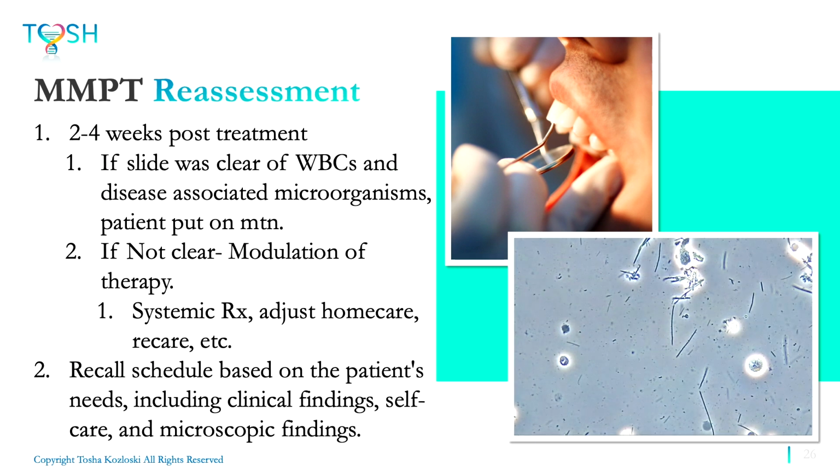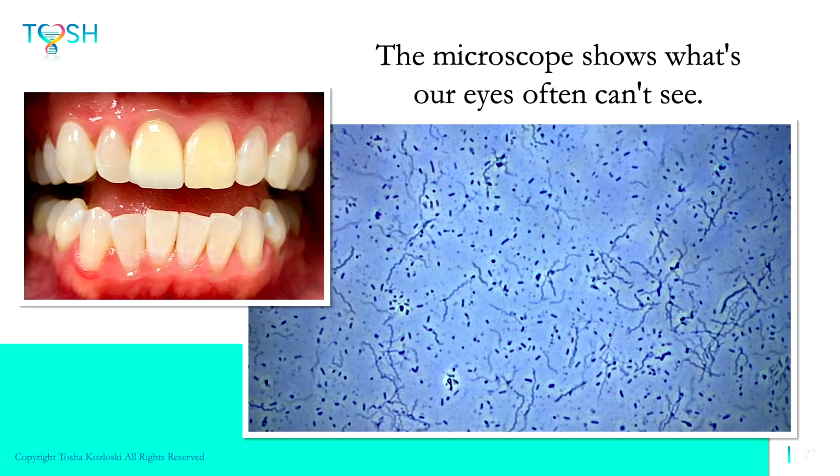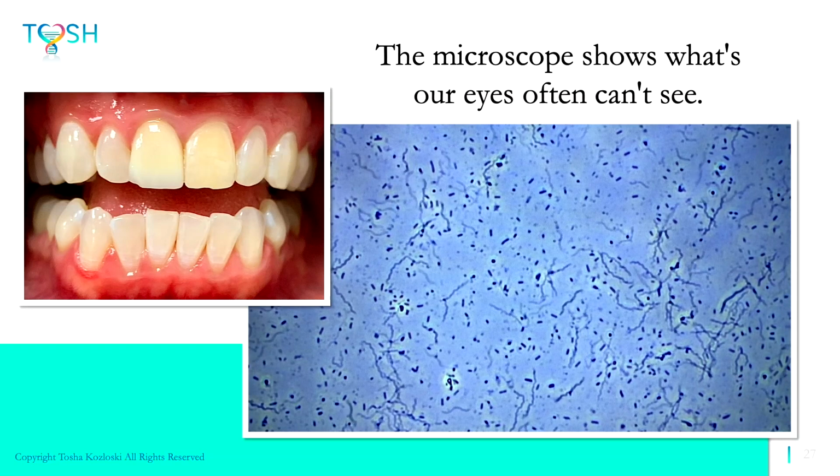And then their recare was always going to be based on what it looked like each time, what the patient was able to do for themselves at home. What does that patient's medical history look like? So no longer a one-size-fits-all approach, but just recommending what the most optimal care is going to be for that patient. I love the microscope because it shows us what our eyes often can't see.